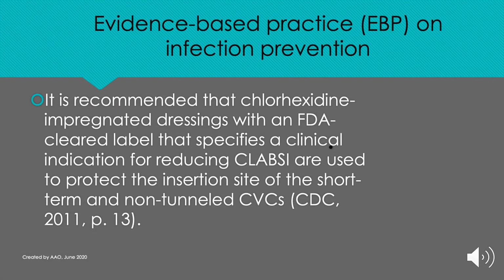Evidence-based practice on infection prevention. It is recommended that chlorhexidine-impregnated dressings with an FDA-cleared label that specifies a clinical indication for reducing CLABSI are used to protect the insertion site of short-term, non-tunneled CVC catheters. And this was recommended by the CDC in 2011 for their guidelines. And this guideline was also revised in 2017, and it has been updated. However, it is still recommending the same thing.